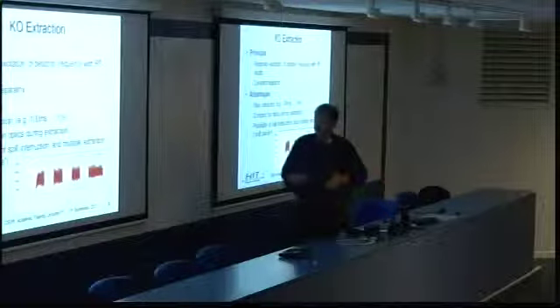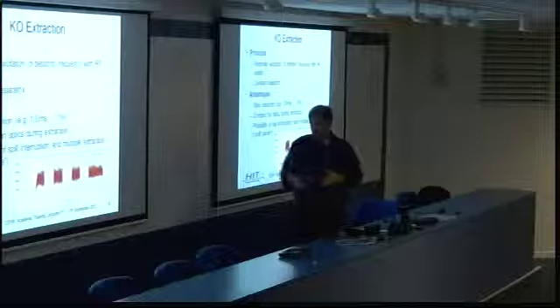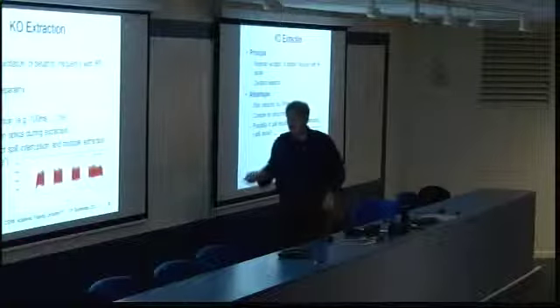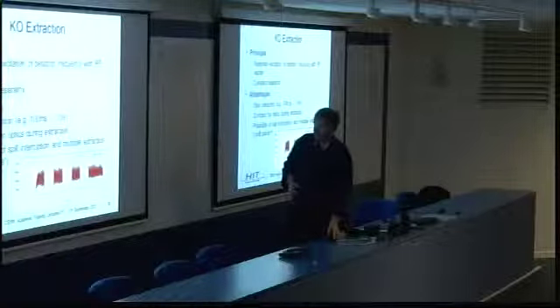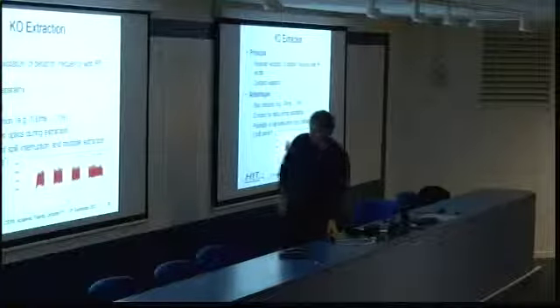Then you have to interrupt the beam, virtually go with the beam to the next area you want to irradiate, switch on the beam, do that, and so on and so on. So this is normally used because tumors are not so compact that you always have only one constant area to irradiate. So this is a very often used feature.